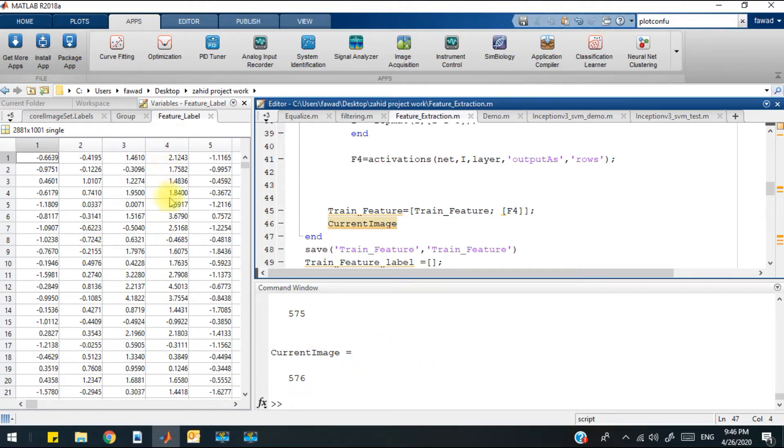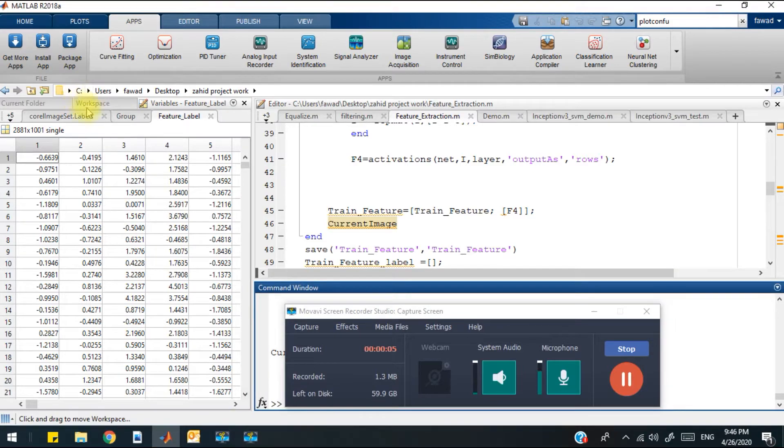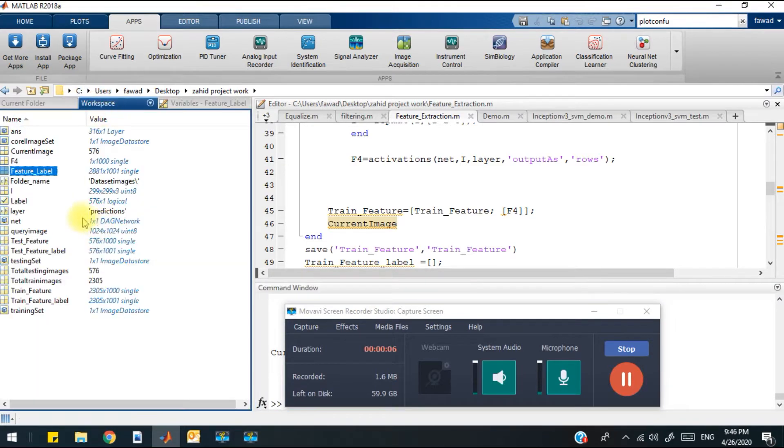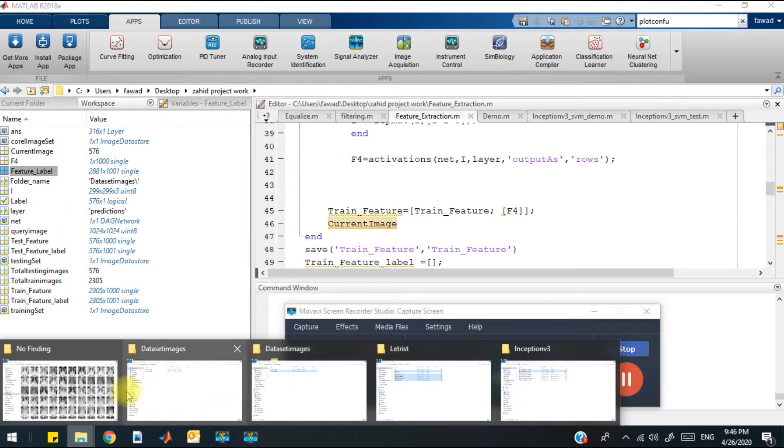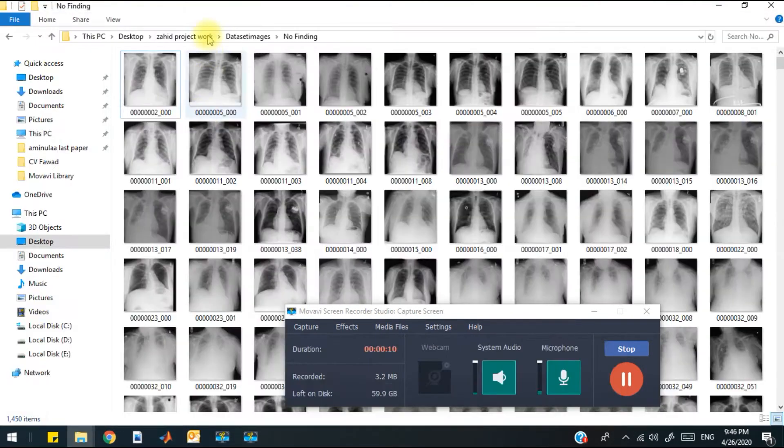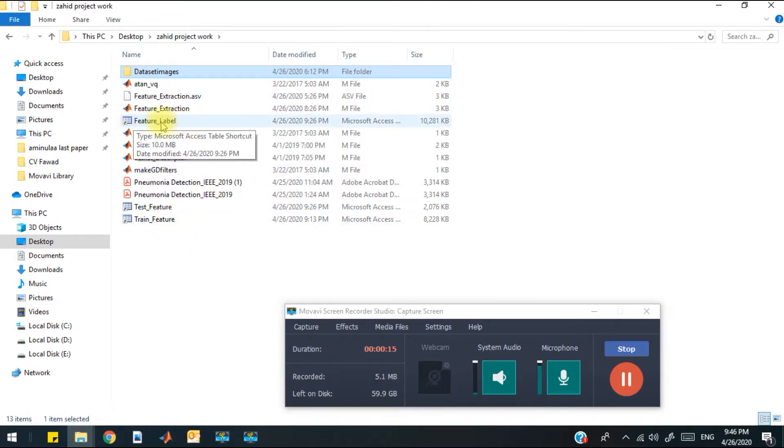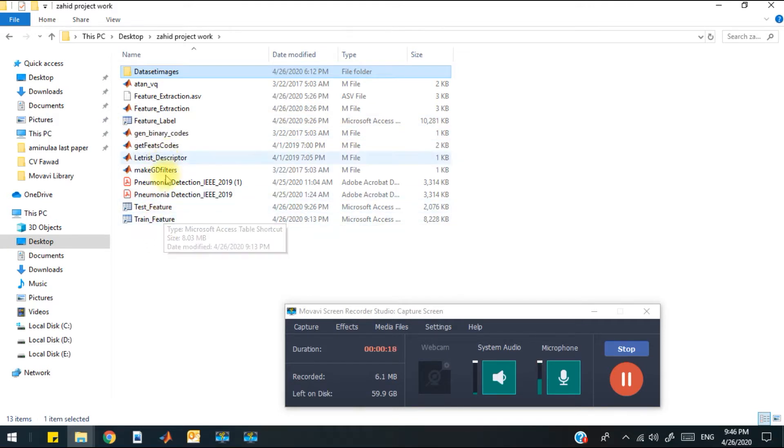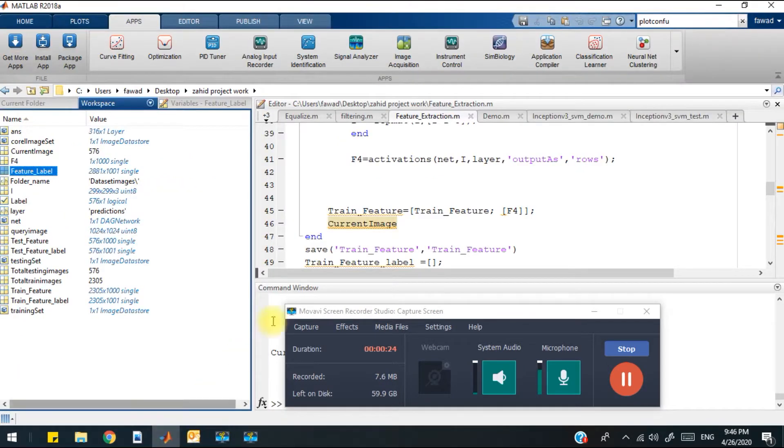Now it's the second part of the code. You can see that within this folder I have got the feature label, test feature, train feature - all the .mat files have been obtained. The next task is to find the area under the curve, the AUC.